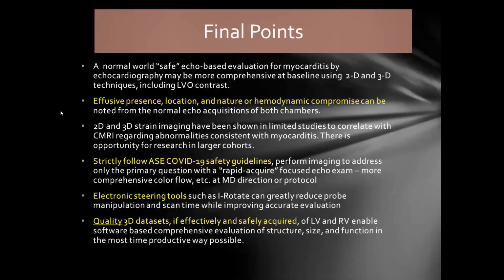If they have a lot of MR, TR, you should be very clear on what they want or don't want at that point or that day or time regarding valvular correlation with the dilation or the dysfunction. If they don't really need a lot of PISA and all that, just be sure you're very clear before you go in the room what they expect you to acquire.